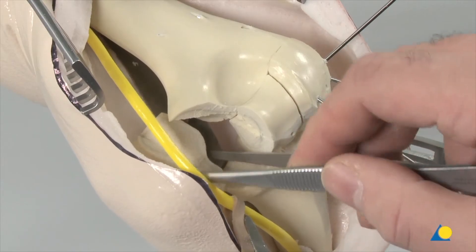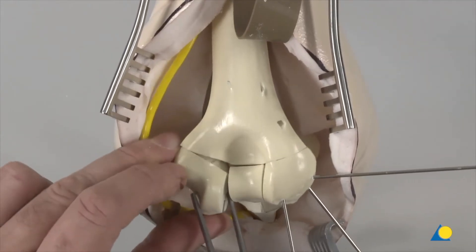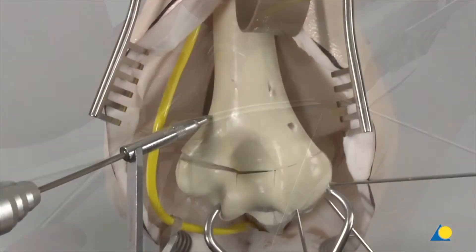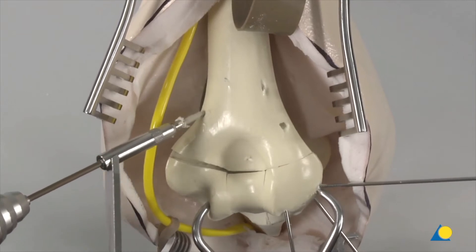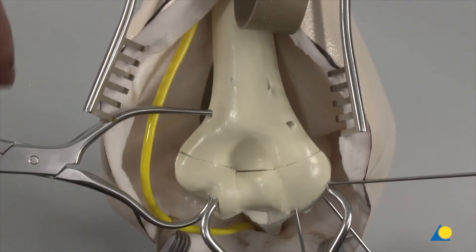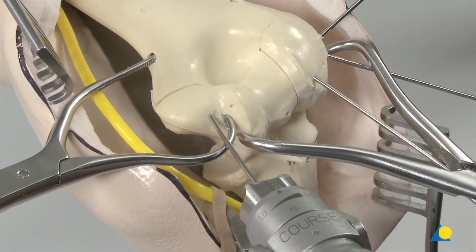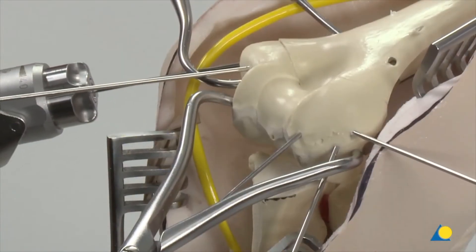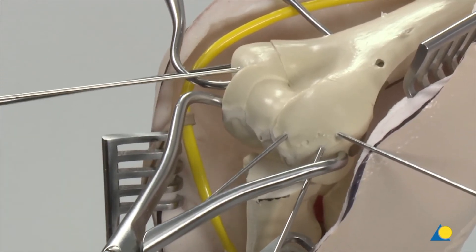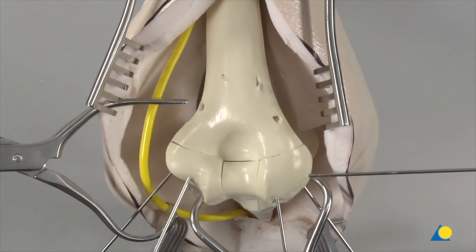The final fragment is reduced to the already reconstructed distal humerus. The large pointed reduction forceps are applied across the fragments. A 2.5 mm hole is made in the ulna column for the asymmetric reduction forceps. The forceps are applied. Two K-wires are inserted to hold this fragment in position. The transarticular fixation K-wire is inserted further. Both forceps are now removed.